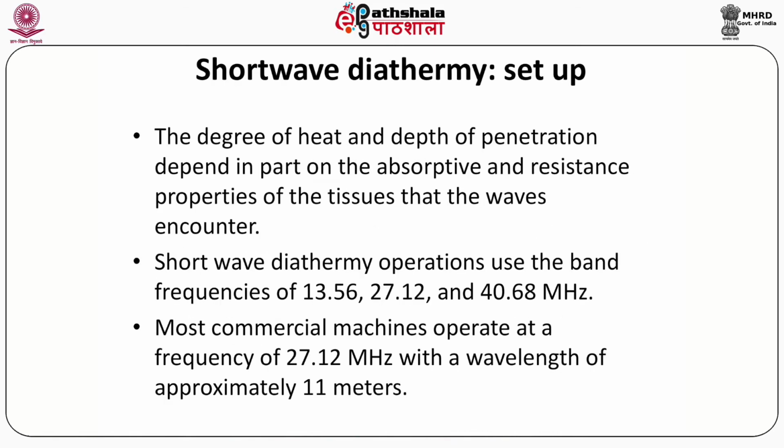So continuing with the setup of shortwave diathermy, the degree of heat and depth of penetration depend in part on the absorptive and resistance properties of the tissues. So the more the resistance and the absorptive power of the tissues, the more heat is generated. Shortwave diathermy operations use the band frequencies of 13.56, 27.12, or 40.68 megahertz. So these three band frequencies are being used for the shortwave diathermy.